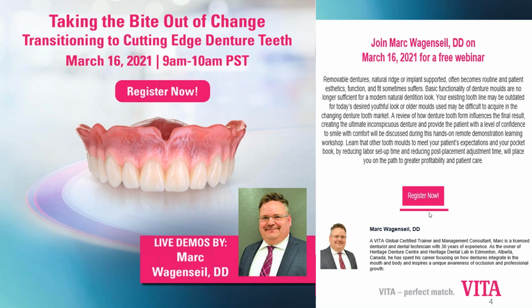Earlier you had spoken about self-polishing, the teeth kind of self-polish. Can you elaborate on that any more? So microscopically, when you cut acrylic, it leaves an abrasion on the acrylic. And now because of the impregnated glass particles or silica inside VITA teeth, it changes that abrasion, and then the teeth polish because they're glass. So as they function against each other, they polish each other.